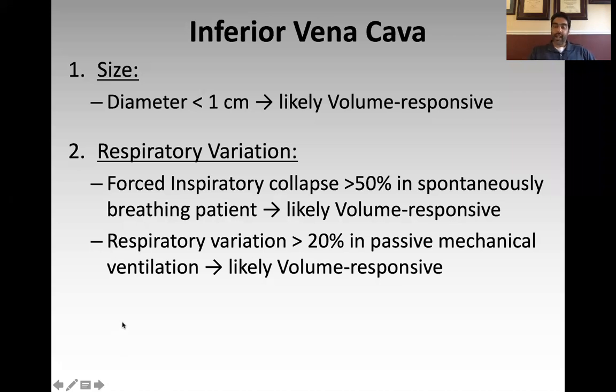The last thing we look at is the IVC. I will say that the IVC is a source of a lot of consternation, both with students of ultrasound and teachers of ultrasound. One of the things that annoys me the most that I overhear on rounds or in the ICU at any given time is a resident or an intern saying, I want to figure out this patient's volume status, let's look at the IVC. Okay. The IVC, and that's just wrong.